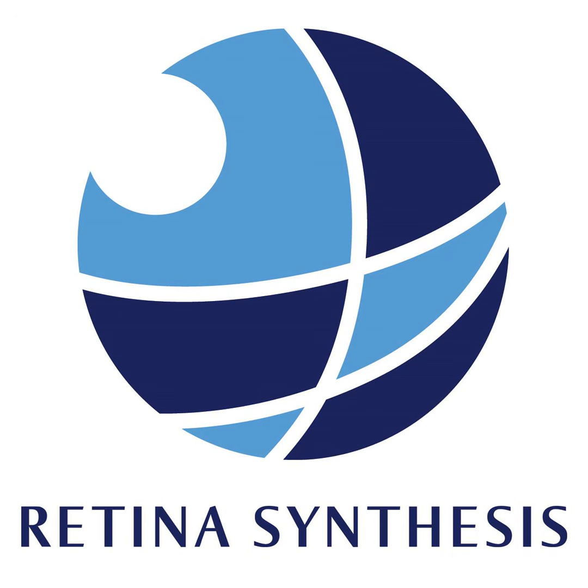So it makes OCT, in my book, the go-to standard for following patients with dry macular degeneration. With a single scan, you can get all this quantitation, or otherwise you need to get infrared reflectance, autofluorescence, individual B scans. Why shop at all these different stores when you can get a single scan, a 6x6 scan using swept source OCT, and just slice it and dice it different ways? I like to say swept source OCT gives us multimodal imaging using a single imaging modality.